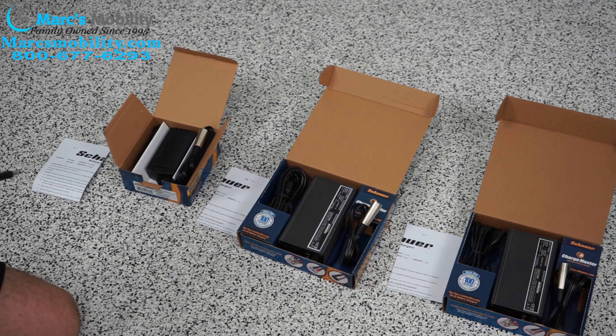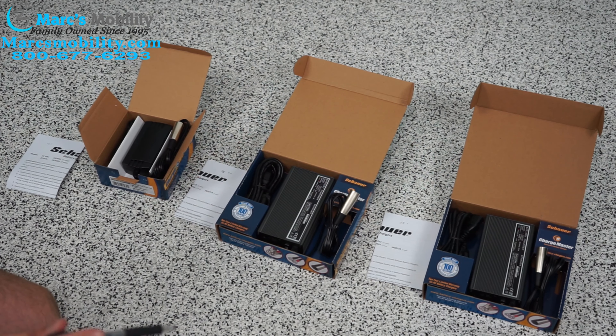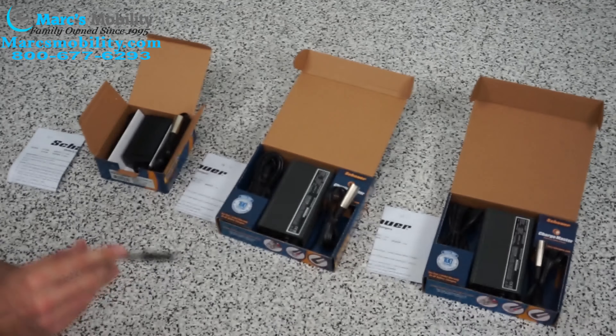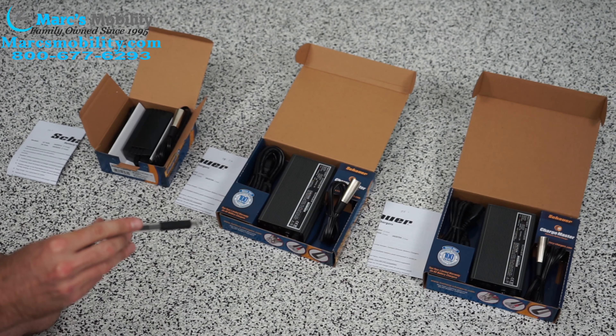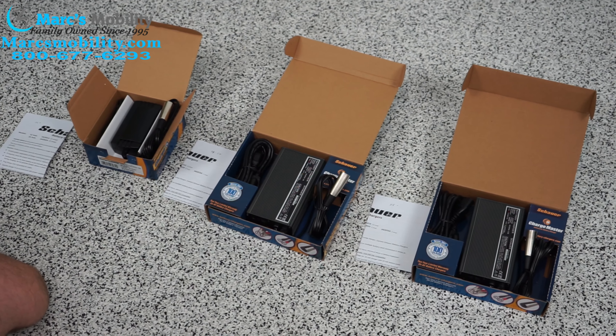You can use the smaller chargers to charge the bigger batteries, like the 55s and 75s — it's just going to take a really long time, double or triple what it would take on the standard charger for that. But you don't want to use the larger charger on the smaller batteries because it can mess them up.